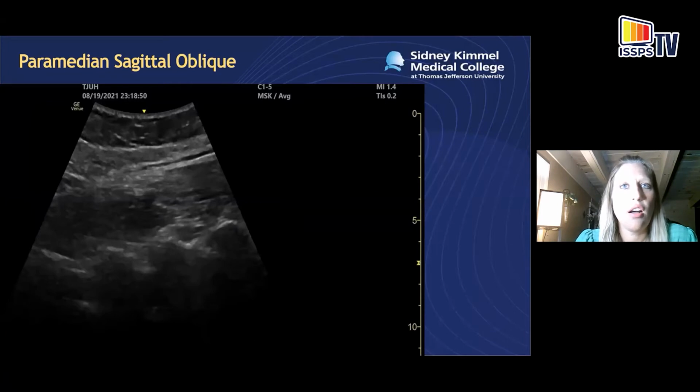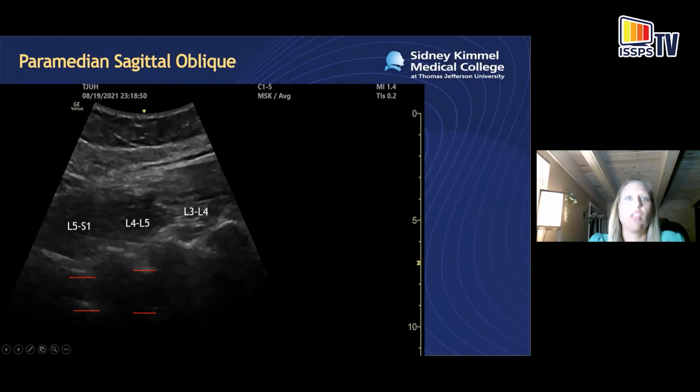And we could see now I've scanned up to look at the different interspaces to mark them. So we can see now L5S1, L4, L5, and L3, L4. Of course, if you ever run into problems in the obese patient, the L5S1 is going to be the largest of the spaces. And we can still probably see some area that might be signifying the different structures of the posterior complex. But again, a lot of them are going to get fairly obstructed, and a lot of them you'll see better in just dynamic scanning.